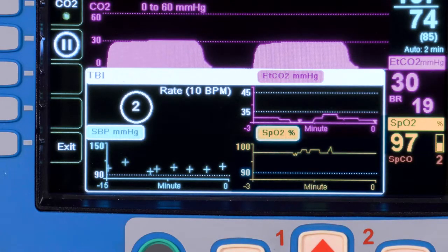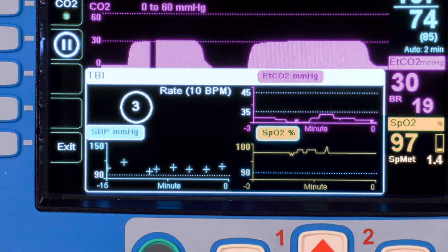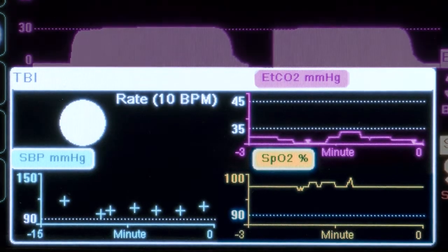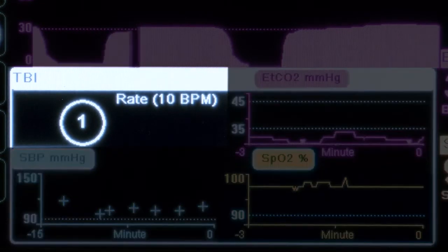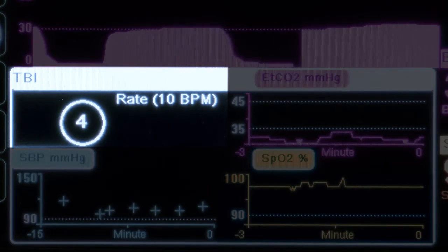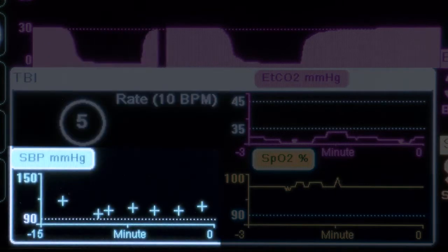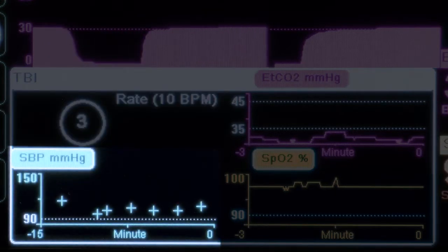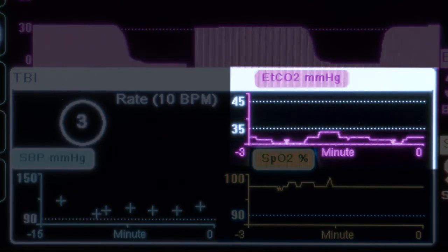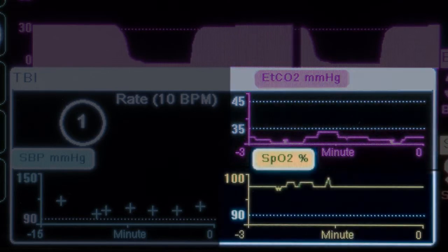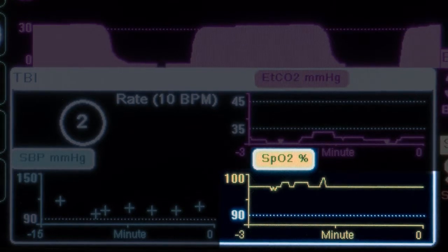When the TBI Dashboard is activated, it will populate the bottom two waveforms of the device screen. The Dashboard is separated into four distinct quadrants. The top left quadrant, shown in white, is the simple ventilation timer designed to assist ventilation timing. The lower left quadrant, shown in blue, is a trend of systolic blood pressure data. The upper right quadrant, shown in magenta, is a trend of capnography data. The lower right quadrant, shown in yellow, is a trend of pulse oximetry data.